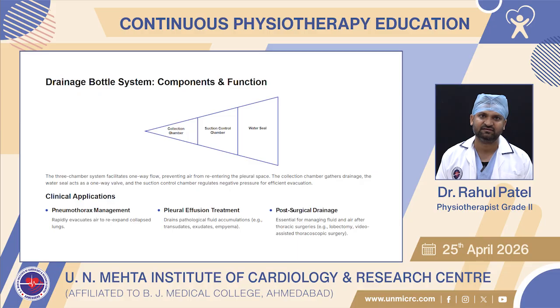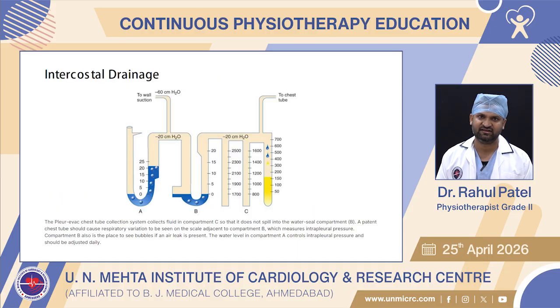Clinical applications: pneumothorax management, rapidly evacuate air to re-expand the collapsed lung. Pleural effusion treatment, drain pathological fluid accumulation, for example transudates, exudates, empyema. Post-surgical drainage, essential for managing fluid and air after thoracic surgery, like lobectomy, video-assisted thoracoscopic surgery, intercostal drainage.